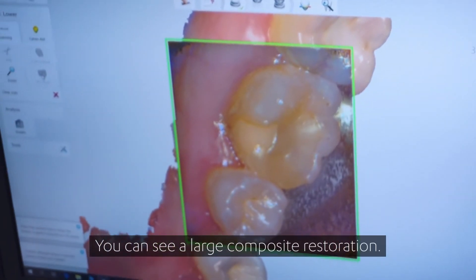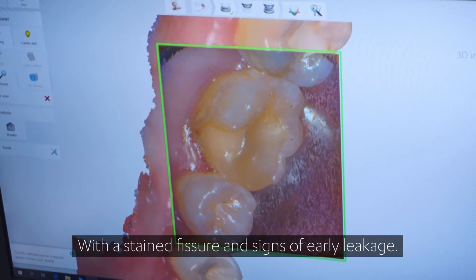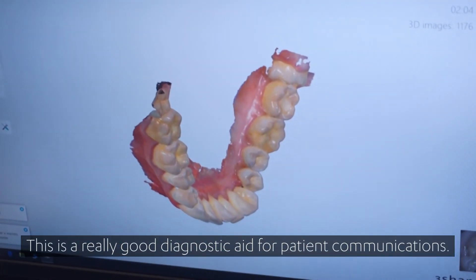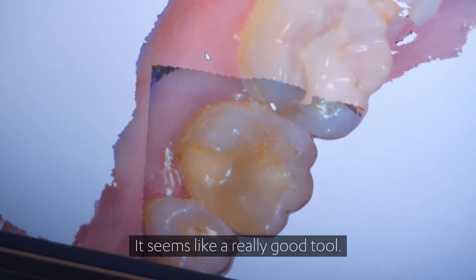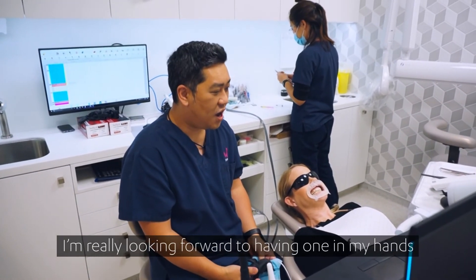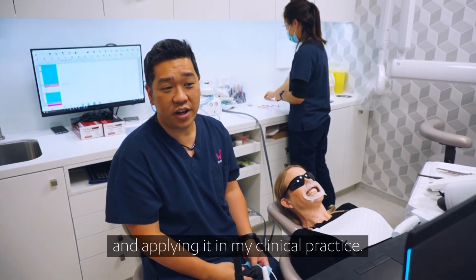You can see a large composite restoration with a stained fissure showing signs of early leakage. This is a really good diagnostic aid for patient communication — you can show patients this. It seems like a really good tool. 3Shape, thank you for letting me test drive the new Trios 4. I'm really looking forward to having one in my own hands and applying it in my clinical practice.